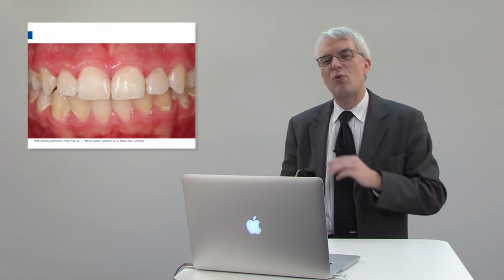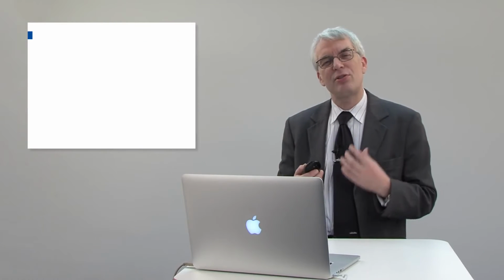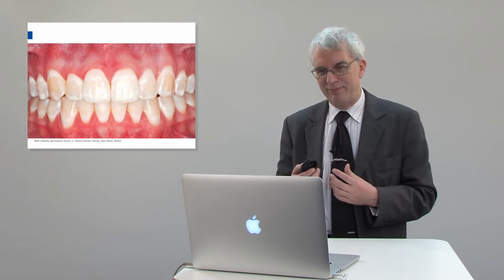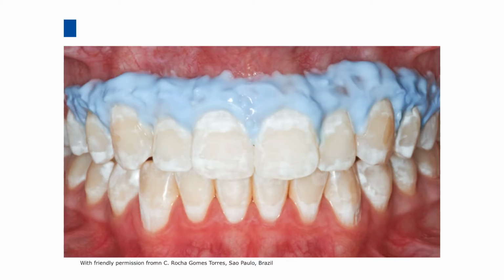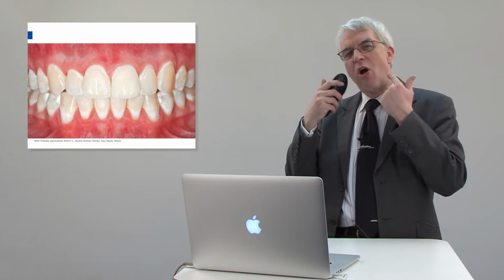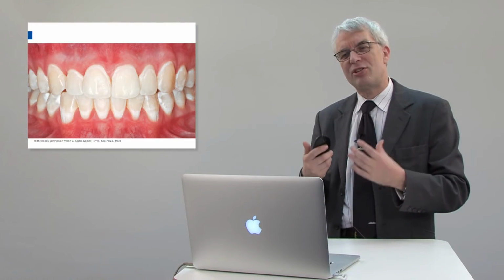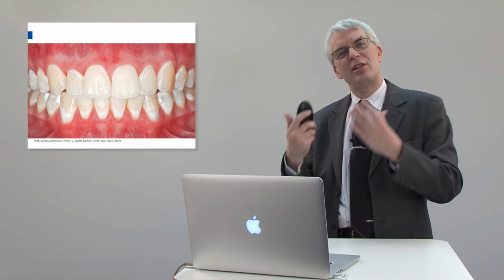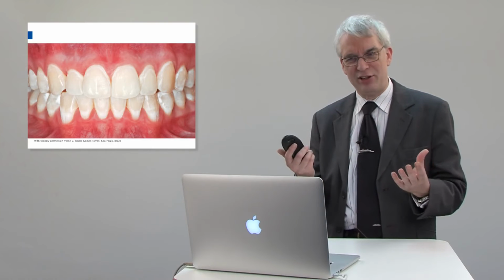And let me show you one more thing, because instead of using rubber dam, you could use something else. You could use a liquid dam. This is a different patient, and liquid dam was applied, and they did the etching and the rinsing and the infiltration, and this is the outcome. So this doesn't look nice. You see, because the liquid dam was applied on the teeth, it protected the lesion, it didn't get etched, you didn't remove the surface layer, and you couldn't infiltrate and make the lesion vanish.